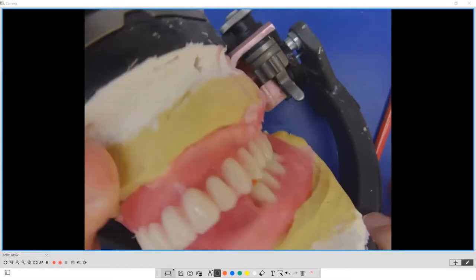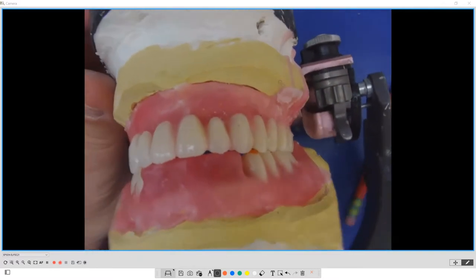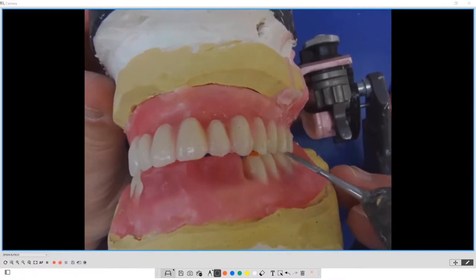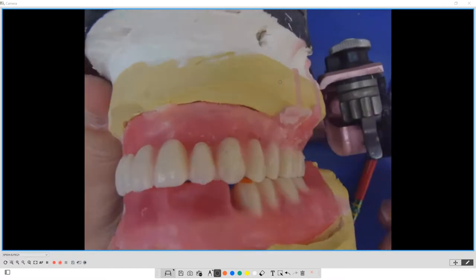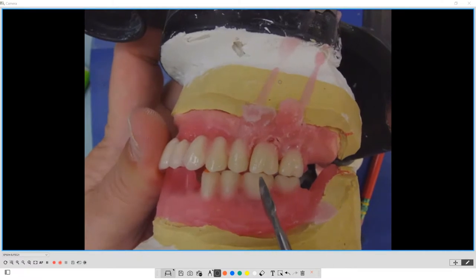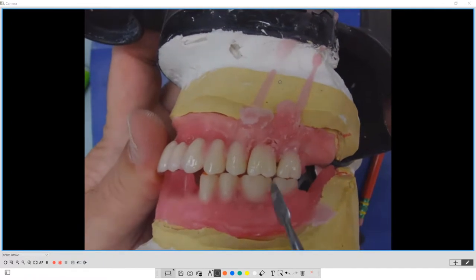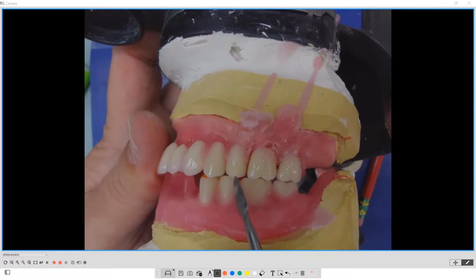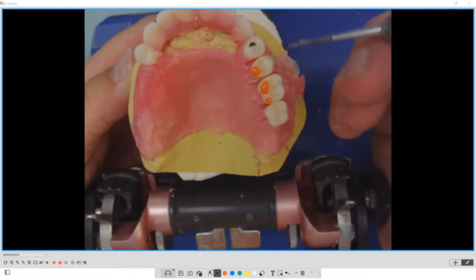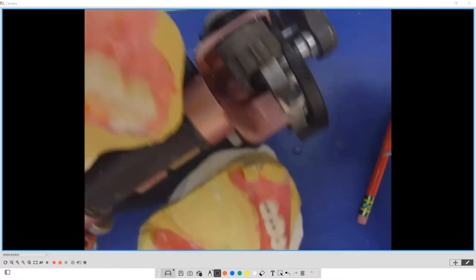So I have the ability now, as I slowly turn, and you can see we have overlap. This is what helps keep the food on the food table to get crushed. We have slight gapping so that, again, the food can stay on, because when you have knuckle tight occlusion, it squeezes all the food off. It's less efficient. Remember the chewing video. You need some of the food to stay on here to continue to get crushed. The teeth have a bow to them. So you can see we've got a nice bow, which helps push the cheek out.